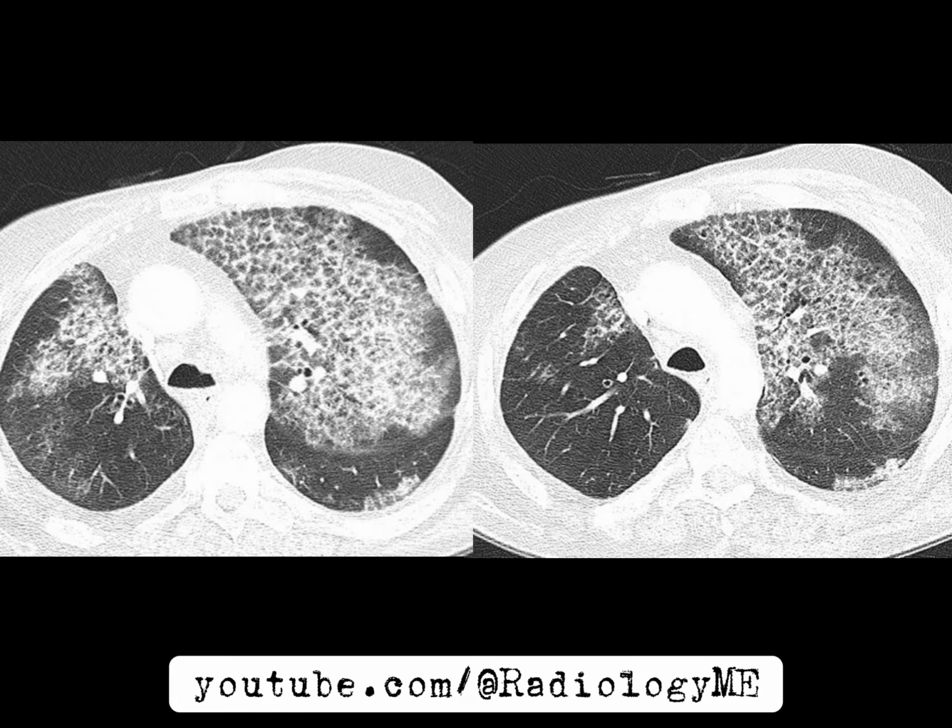Now, here's where it gets juicy. The axial images, those slices we love, show patchy ground glass opacification. And when I say patchy, I mean it looks like someone's taken a soft sponge and dabbed it all over the lungs. It's pretty clear something is going on in those alveoli. And wait, there's more. The interlobular and intralobular septa are thickened too. So I'm thinking, okay, we've got a mix of abnormalities in these lung segments. The lung apices are pretty chill, though, with normal lung parenchyma. Phew. At least something is behaving, right?